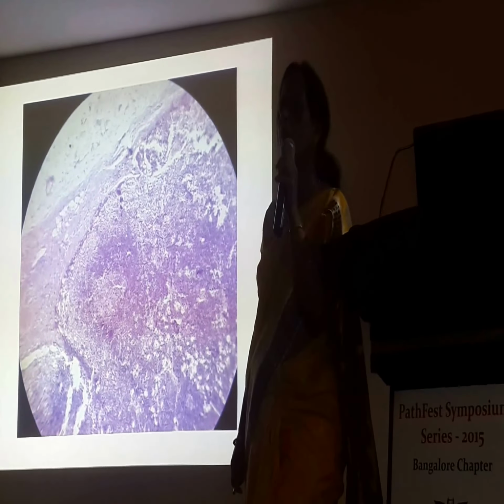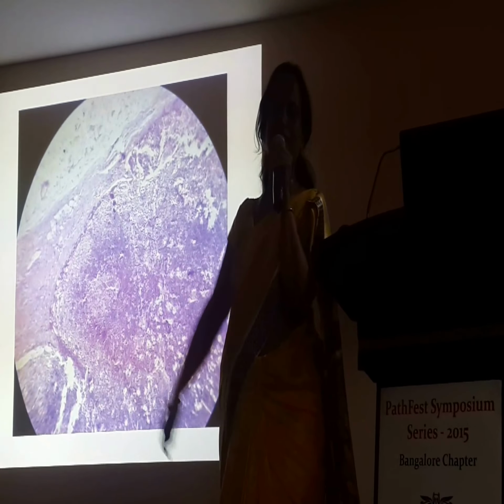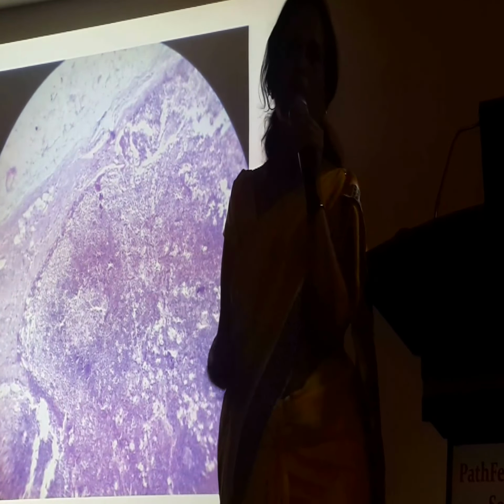Lymph node is a graveyard for the pathologist. Very, very difficult. The cases which Dr. Hazarika presented, if you're in an onco institute, that's easy for you because you go with all the panels. Not for general pathologists like us in the periphery, where we do not get all these panels done. Even if you want to do it academically, it becomes very difficult because the private management will question you if you're spending, and the patients who come to us cannot afford it. Next, any observation here?